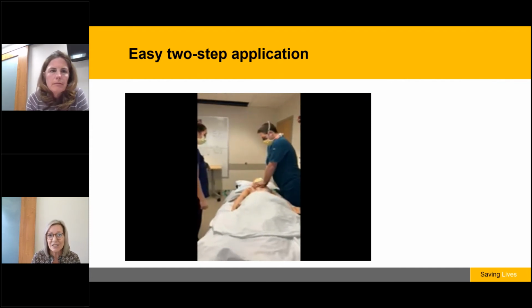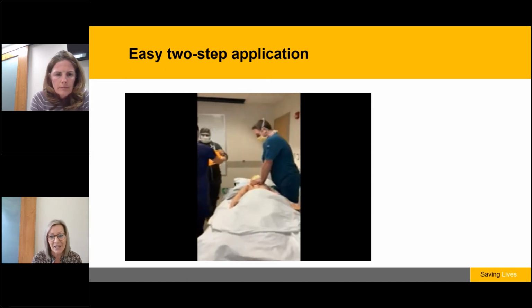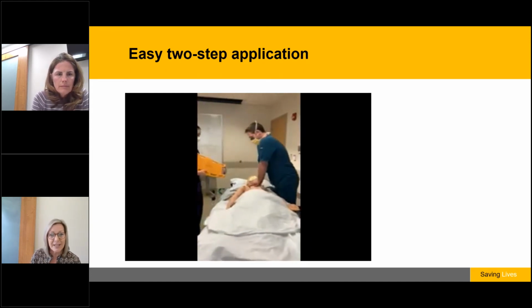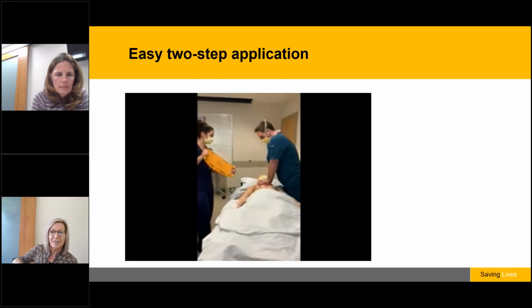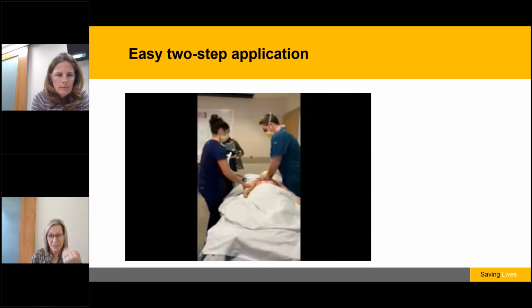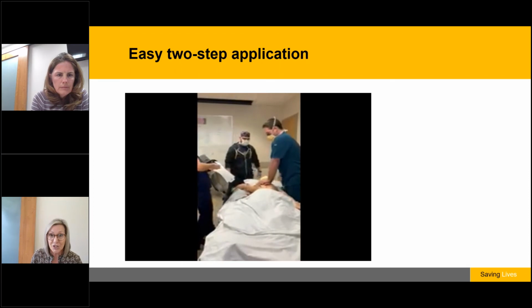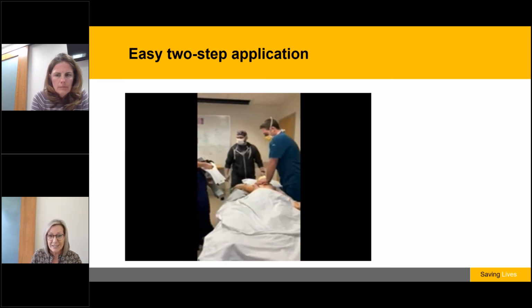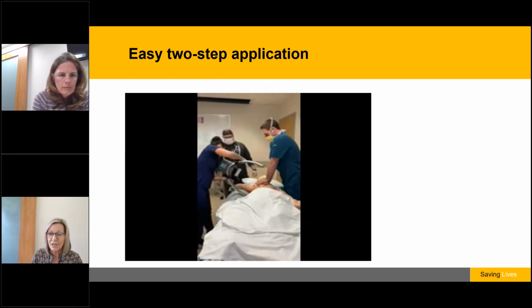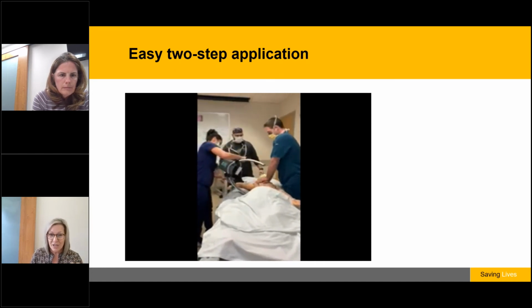So the bedside nurse is doing CPR. The acute shock resource nurse comes, gets the device out. They get the backboard in place, and they're going to slide it underneath there where they get it positioned perfectly. We did a lot of training to do that. So backboard's under, CPR continues. Now the device is turned on. It gets clicked in place on one side while CPR continues. Device is ready to go.